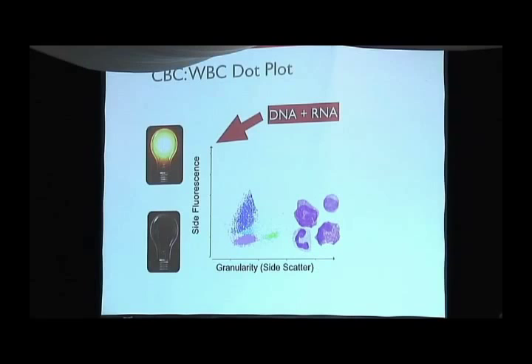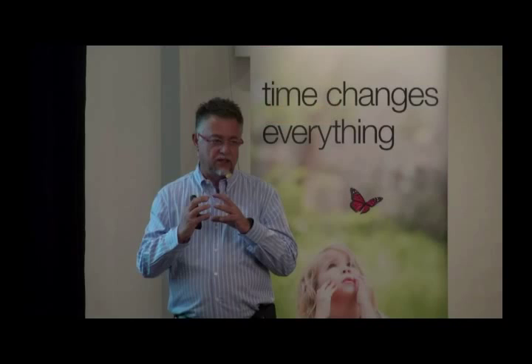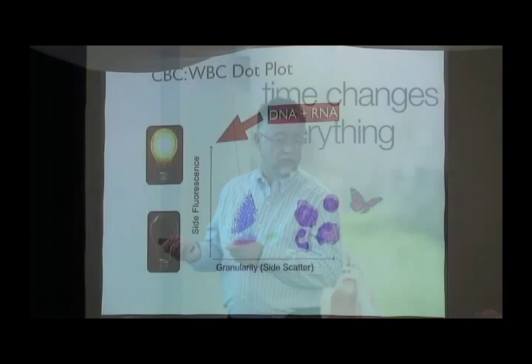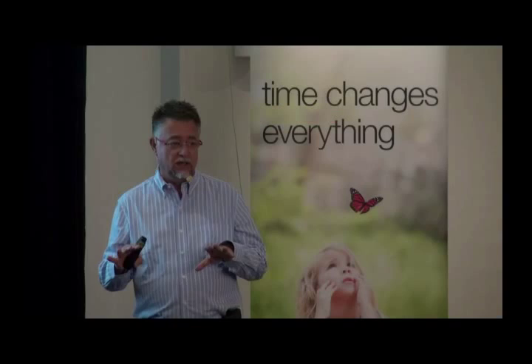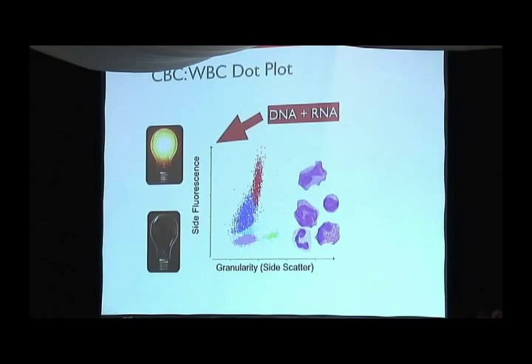Lymphocytes, remember, if you look at the mass of the cell, because most of the cell is nucleus, they have a very narrow rim of cytoplasm, they will glow a lot more than a neutrophil, all right? So they live on the floor above the neutrophils. And the monocytes, they have a big nucleus that has a lot of DNA, and remember the cytoplasm is light blue, and it's light blue because it has RNA. So this axis then, as I was telling you before, is a composite between the DNA in the nucleus and the RNA in the cytoplasm, all right?